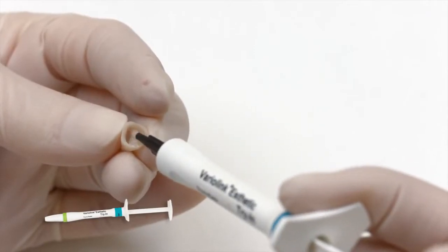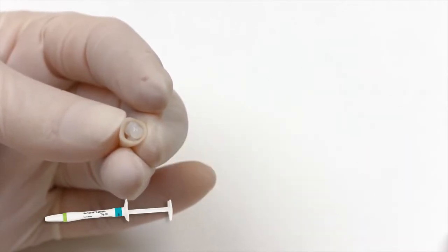For optimum aesthetic results, use Variolink Aesthetic Try-In Paste to evaluate the shade of the restoration.